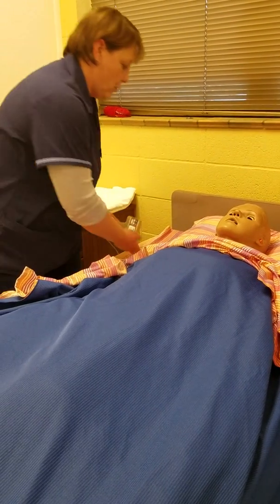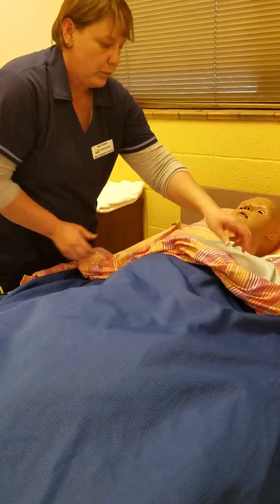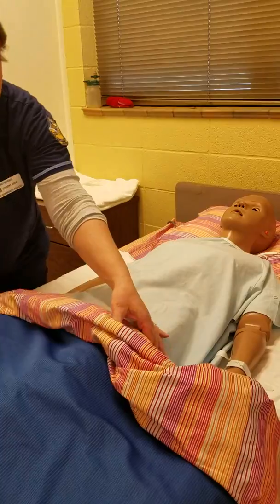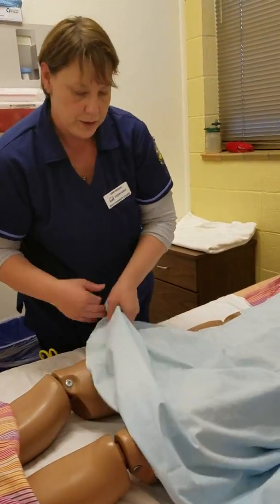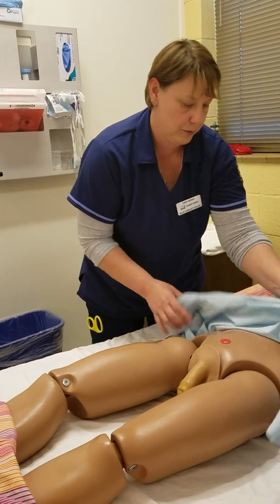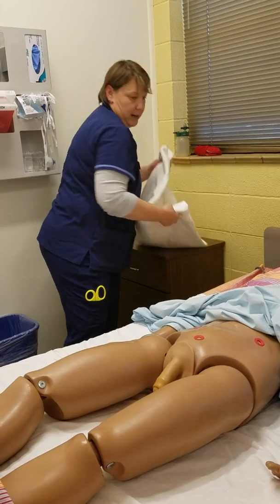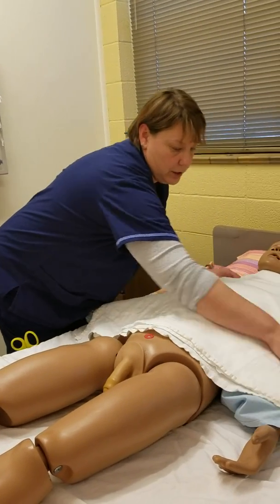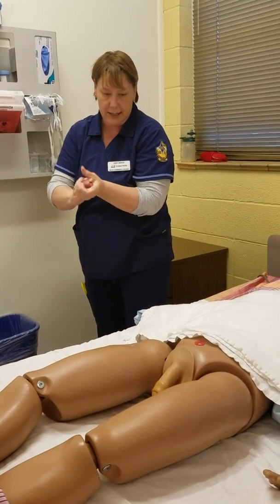Jose, have you ever had a catheter before? He tells me no, so I'm going to explain the procedure to him. What I'm going to do is place a tube into the urethra that will reach up to the bladder, and once it's in and set, it'll drain the urine. While I'm telling him that, I'm going to get him ready and prepare him for the procedure.